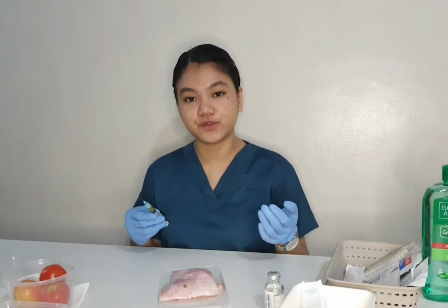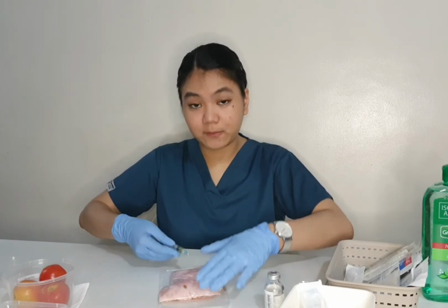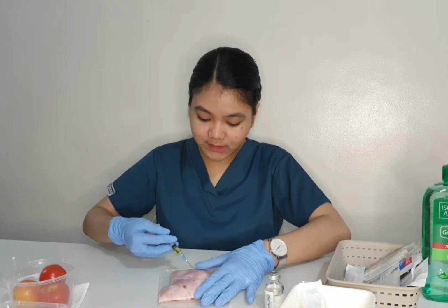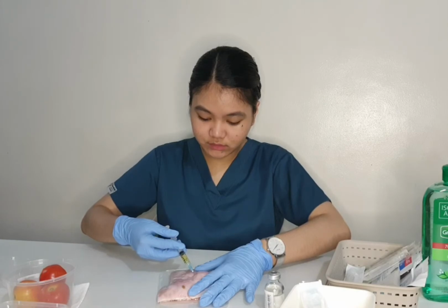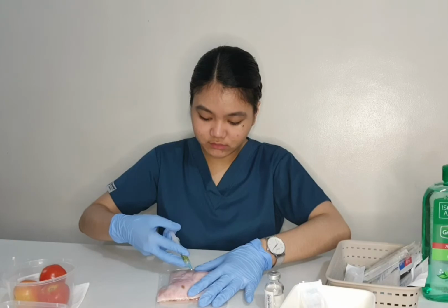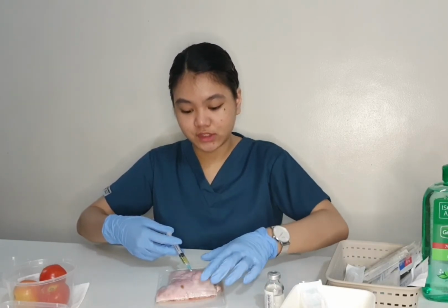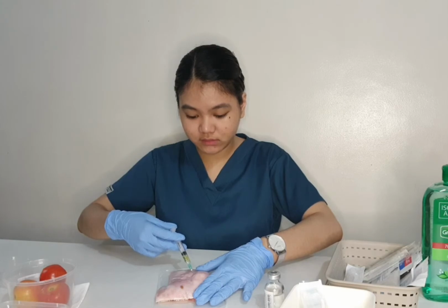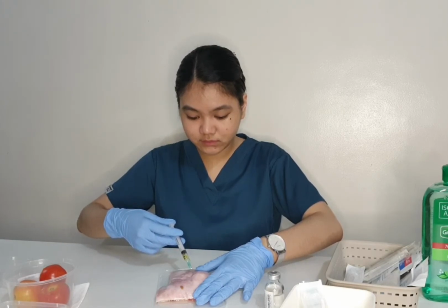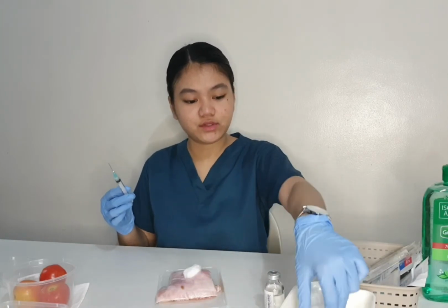Let's now inject it to the patient using the 45-degree angle. And make sure that the hole of the needle is facing upward, the upward skin facing us. Okay, 45-degree angle. There you go. And then pull the plunger. And if there's no blood coming out, then we can now continue pushing the plunger, administering the medication to the patient. Slowly. Okay. Then throw the needle.